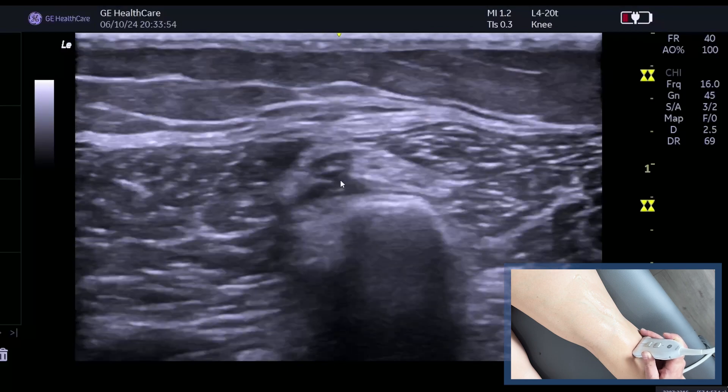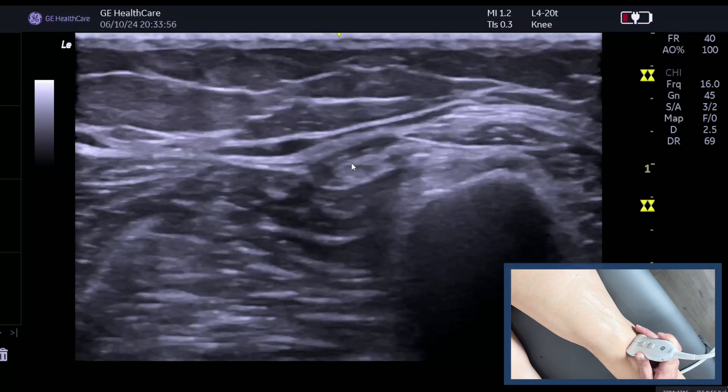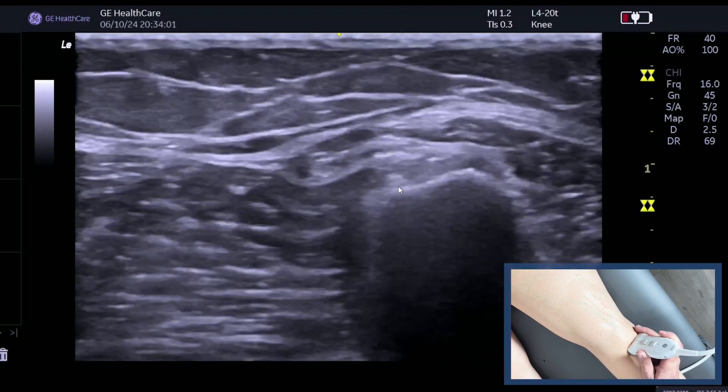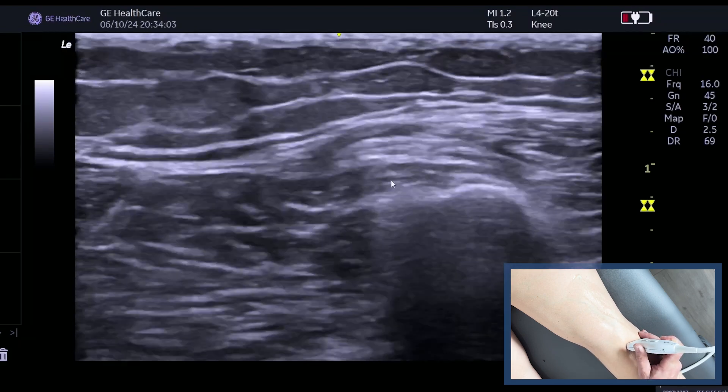So really look carefully at the size of the nerve as it passes over the fibula, looking for any signs of trauma. You can obviously spin on that as well.